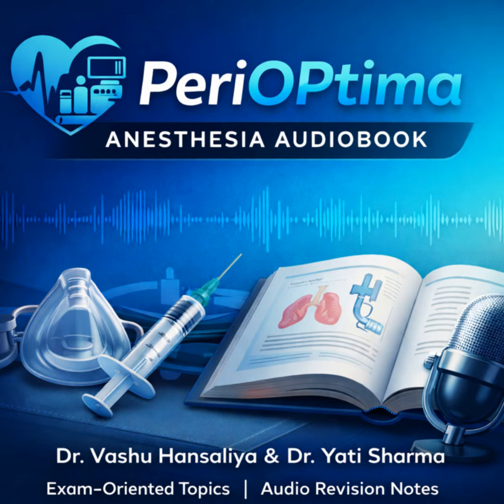How does that placement protect against leaks? Well, if a leak were to happen upstream of the O2 flowmeter, say at the N2O connection point, that leak would only pull away N2O and air. Leaving the oxygen flow intact. Exactly. It leaves the proportional flow of oxygen intact and ensures the patient still gets the necessary O2. If the O2 were upstream, a leak could preferentially pull the oxygen away from the mixture, creating a subtle hypoxic mix that the proportioning system might not detect immediately. So the downstream placement maximizes the integrity of the O2 delivery path. That's the perfect way to phrase it.